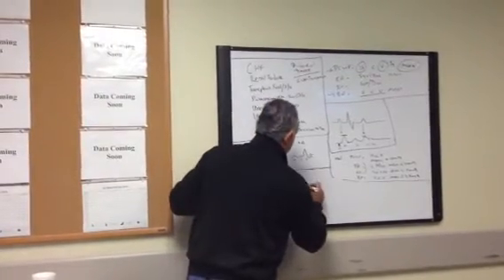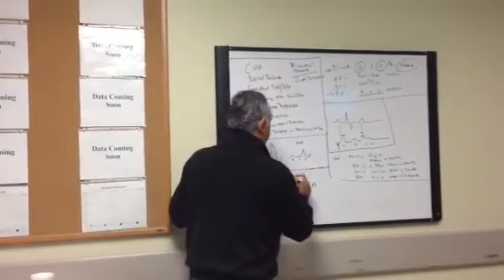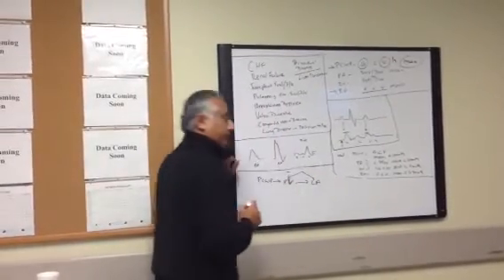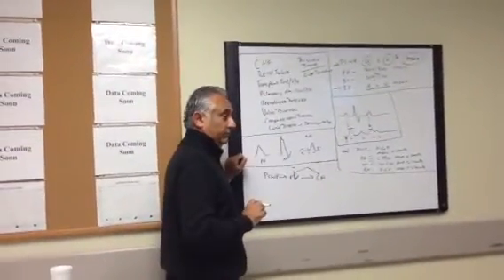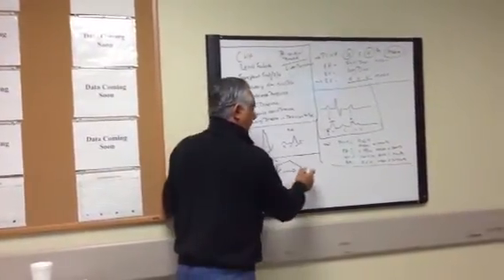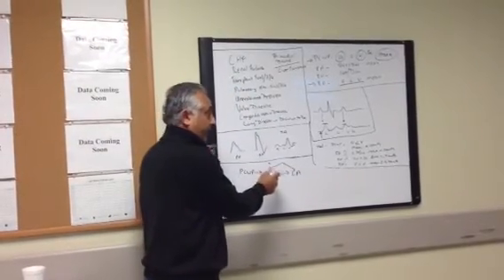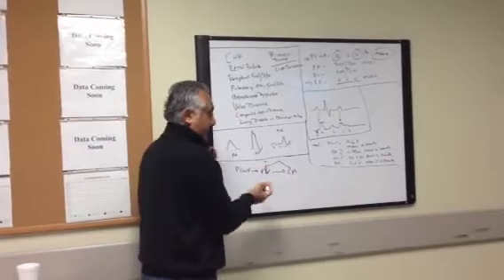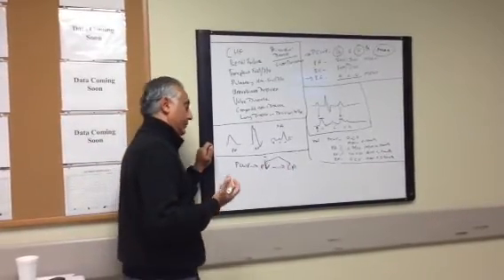Now the pulmonary vein is going to go on to the left atrium, all right? So that should be the same. This should be the same. And so if I can just sneak into the left atrium through an ASD or a PFO, well then guess what? I can get a left atrial sat. A lot of times you'll see me do that instead of getting the wedge sat because I'm so miserable at it that I'll try to get the left atrial sat and see if I can get that.